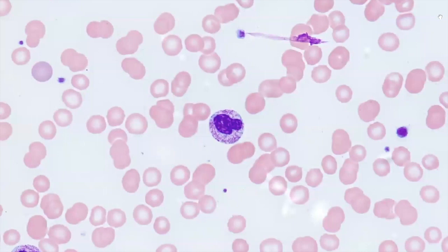Döhle bodies appear as bluish inclusions of variable size in the cytoplasm of neutrophils, but can also be seen in eosinophils and monocytes. The inclusions may be single or multiple, as seen here, and are often located near the inner side of the cell wall and less often anywhere in the cytoplasm. These Döhle bodies represent remnants of rough endoplasmic reticulum or aggregates of denatured free ribosomes.